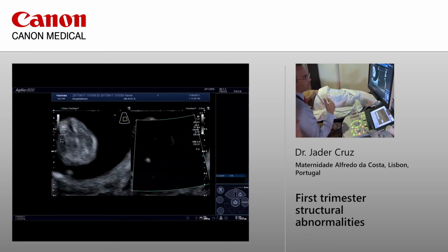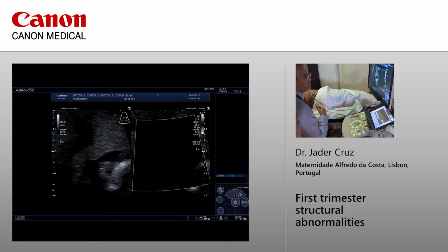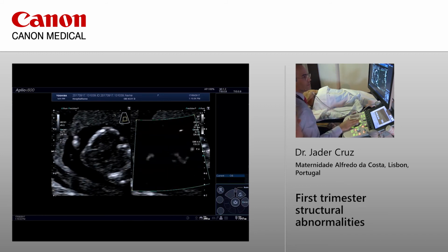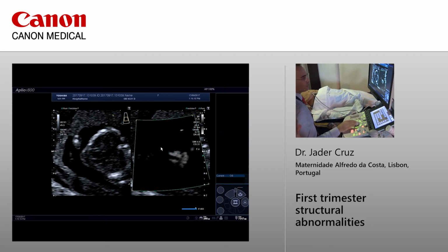And then now the baby just went completely mad. That's good. I wanted to show you that. Look at this image of the four chambers there. You see that in the 2D you don't really see very much. There's something about the SMI that actually works in our favor. A normal Doppler depends a little bit on your insonation angle. SMI, I don't know why, they can explain it to you later, doesn't have this kind of condition that the normal Doppler has. Yes, it has less.